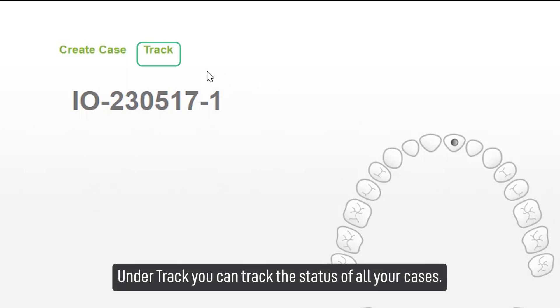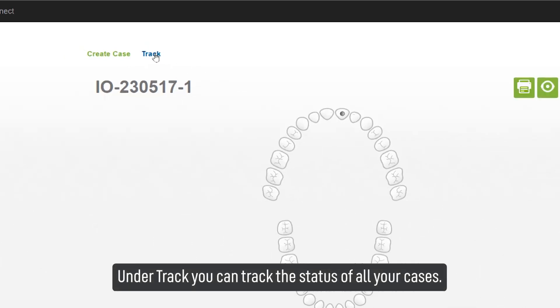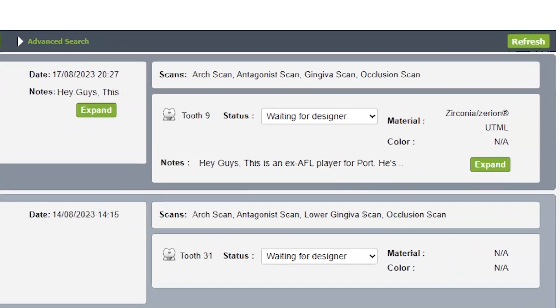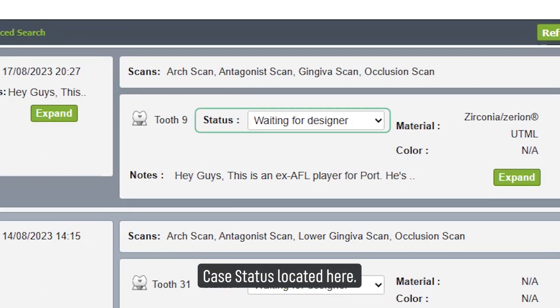Under the Track tab, you can track the status of all your cases. The case status is displayed here.